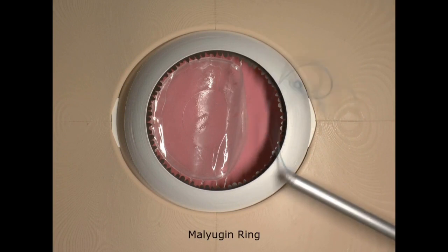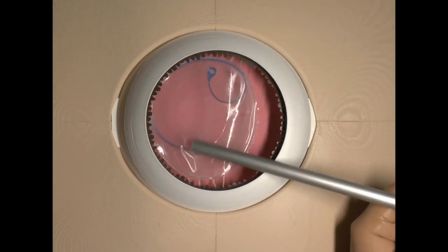The malugins ring is a modification which facilitates the implantation by using an injector.